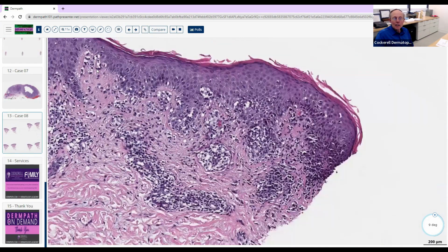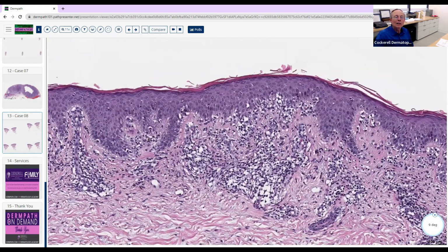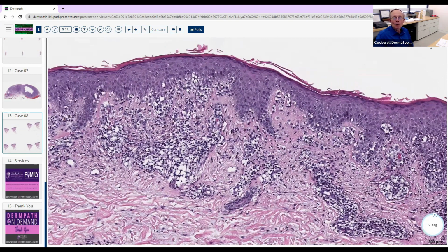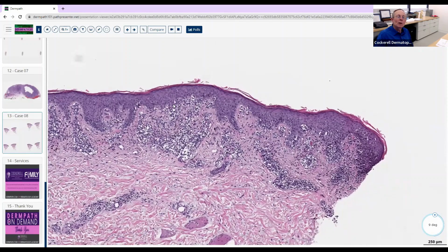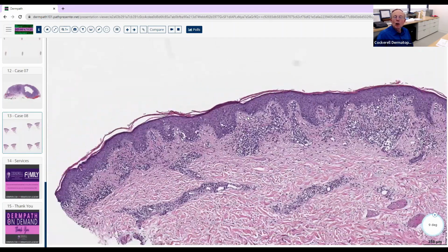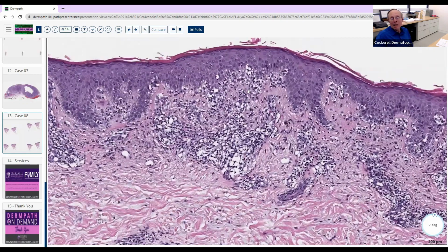Now we've got the diagnosis here, so we've got our answer. So we've got 5 minutes left. So you've got to figure out a way to tap your brain a little bit further. So what else is in the differential diagnosis here? So we look down at our multiple choice list, and what are some things in there that might look like MF, but really is not MF?